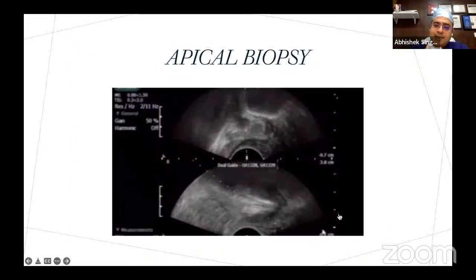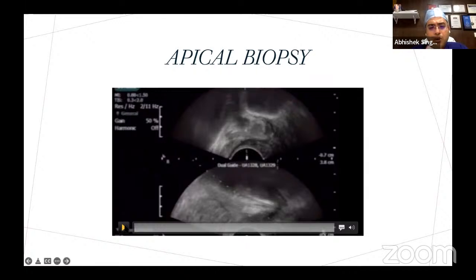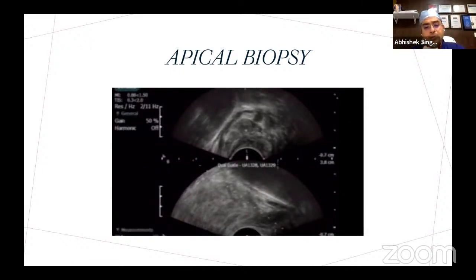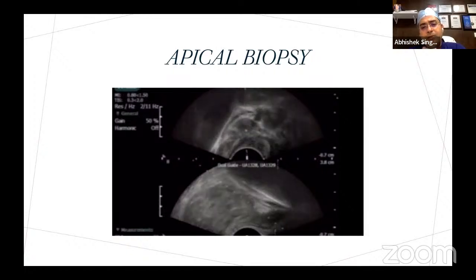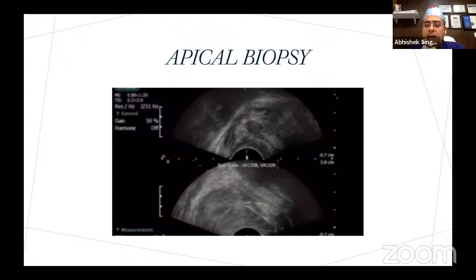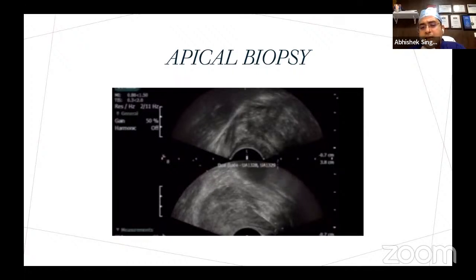Something that I want to discuss in terms of technicality and use of the side firing probe is that sometimes you want to go up really anterior and take the anterior zone biopsy. So that time also you have to use ultrasound very, very intelligently. First is you come right up to the apex. How do you know that you are at the apex? You will see the urethra in cross section rather than the prostate. Now your biopsy line should be hitting the upper 1/4 of the prostate in the sagittal section.